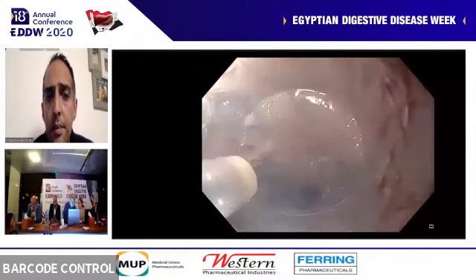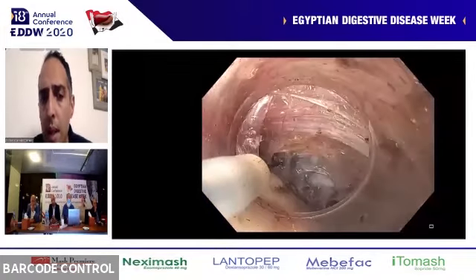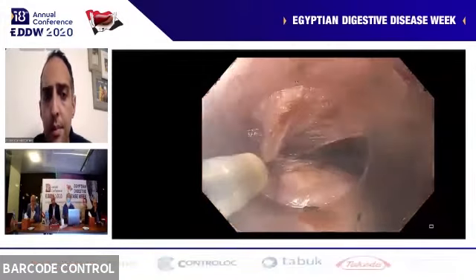We shouldn't cut the capsule. Capsule rupture during tumor removal is a very big problem in oncology. Although I believe with the STER technique it shouldn't be as problematic as in surgery, we still have to keep the capsule intact. Now we cut the last fiber.